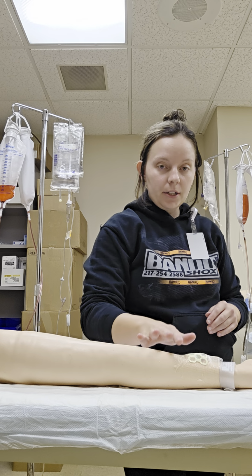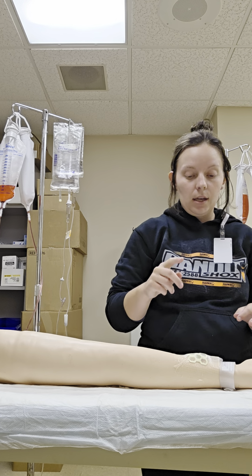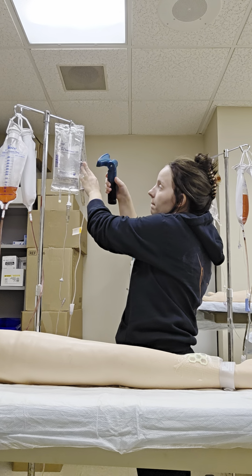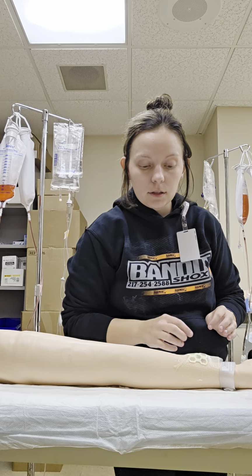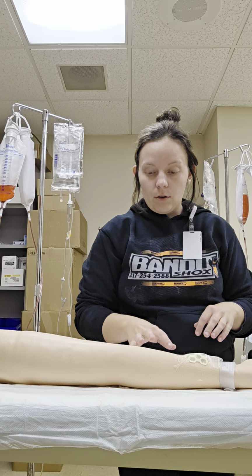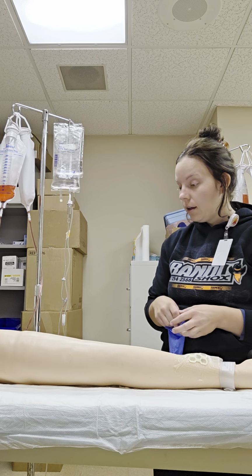I'm going to go ahead and assess for allergies. Mr. Foley has no allergies. So I am going to go ahead and scan my med. So beep. Med is scanned. I'm going to go ahead and just assess his IV real quick. No signs of infiltration, no signs of inflammation. So that looks good. So I'm going to go ahead and put my gloves on here.